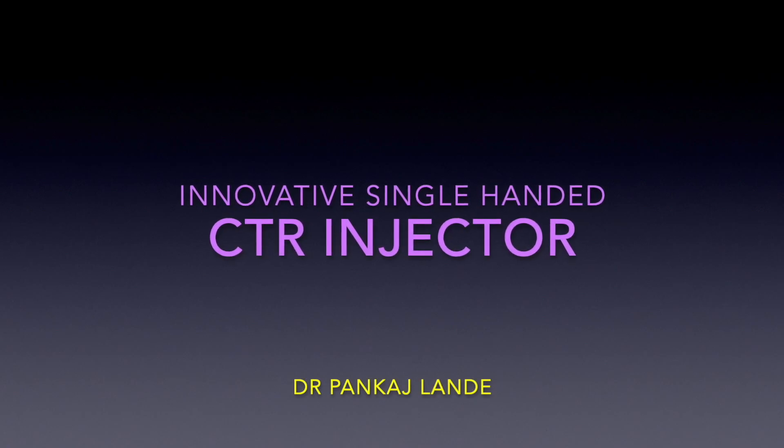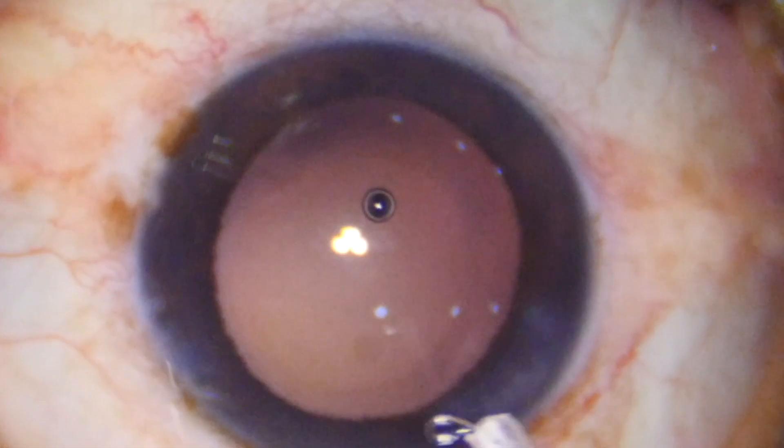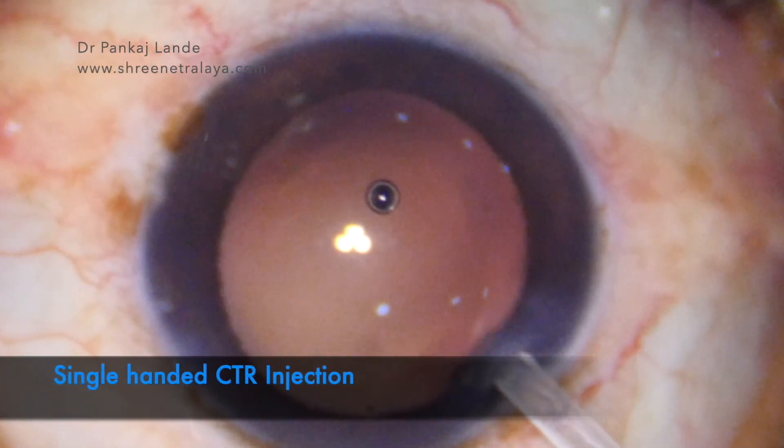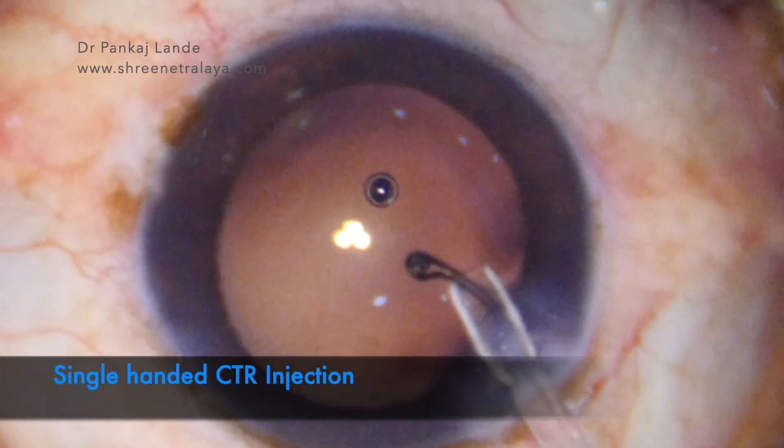Hello friends, welcome to Srinetralay. Here you are seeing a single-handed CTR injection system which is very simple to use.